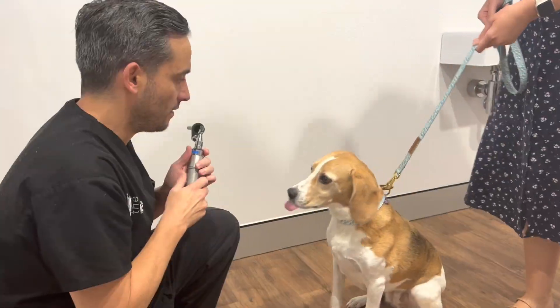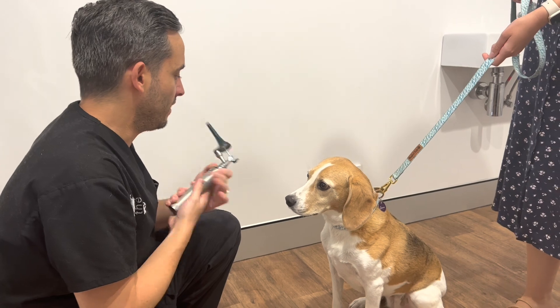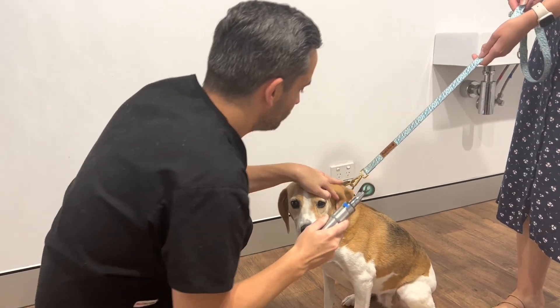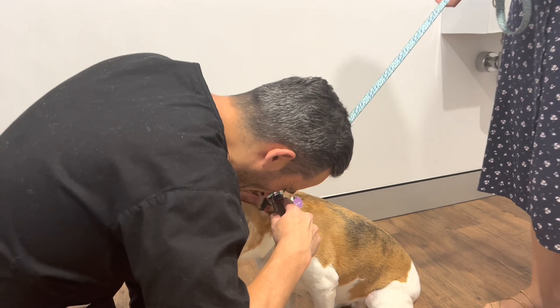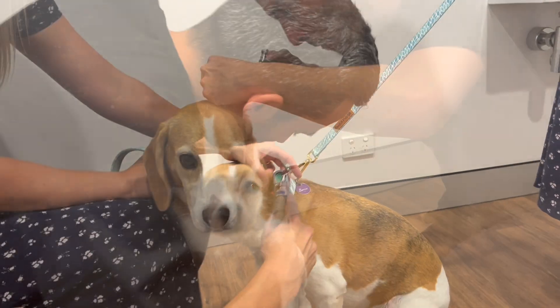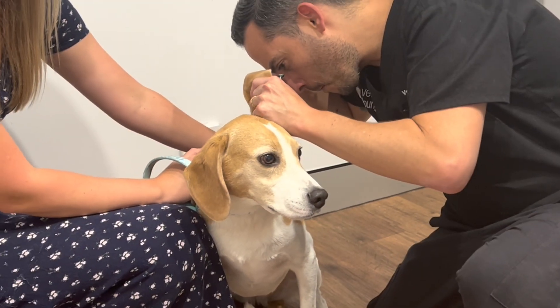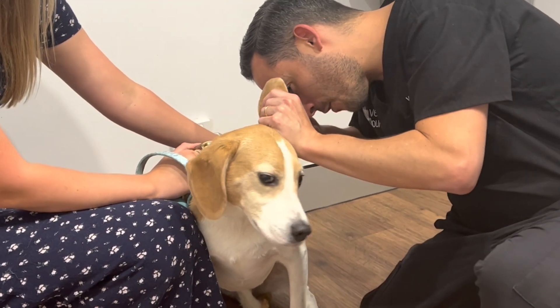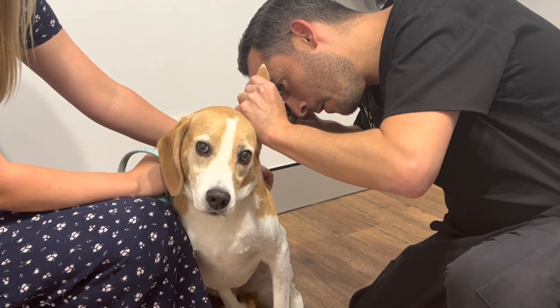A special instrument called an otoscope is used to examine the ear to note physical characteristics such as exudate accumulation, presence of mites or ticks, and the condition of the tympanic membrane — whether it's intact or ruptured.